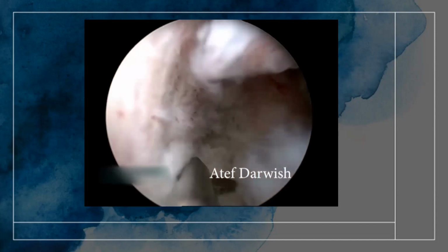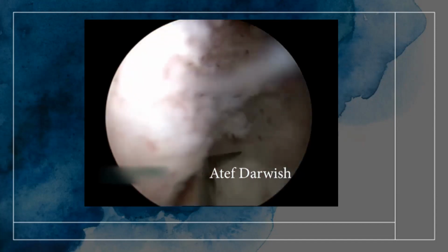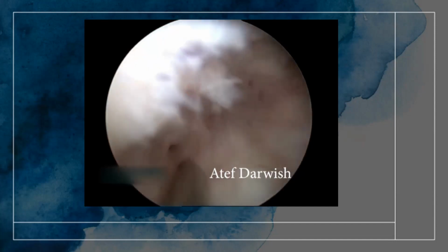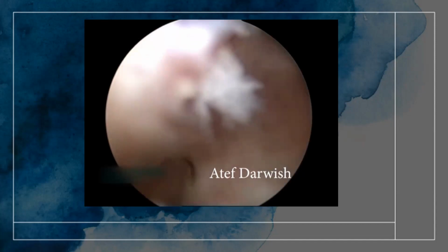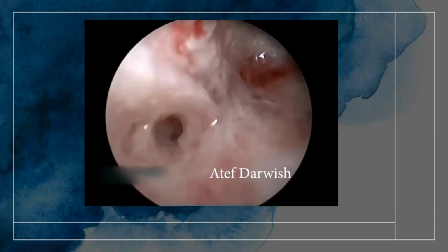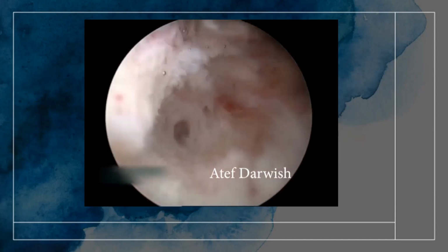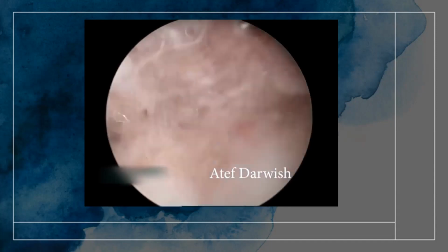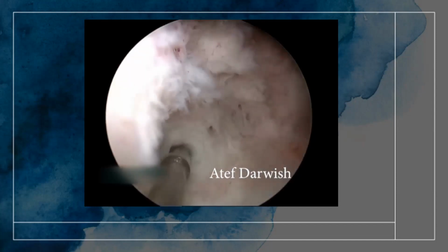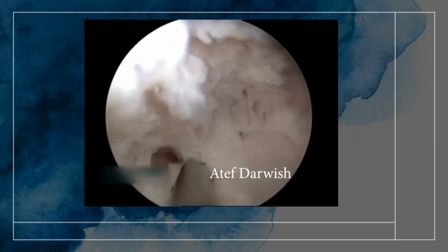Every time you go to the left side to see the ostium and go in a horizontal plane to reach this expected site. Here the lateral wall shows extensive adhesions, and you cut the extensive adhesions, and finally you reach the site, and now air bubbles go inside this site. So this is the site of the ostium, because of the air bubbles, which is the bubble test, as part of the Darwishoscope test of patency and peristalsis, also published by our team.